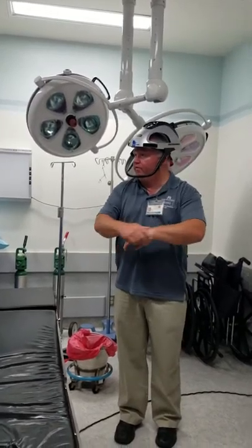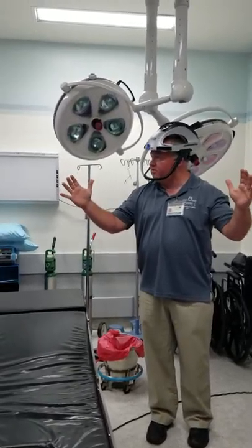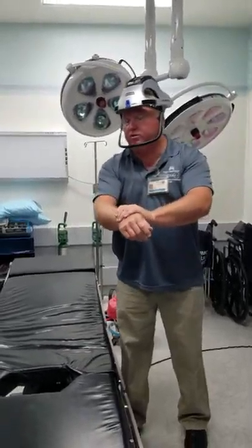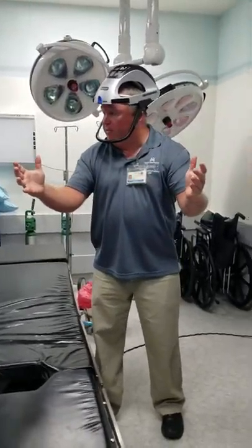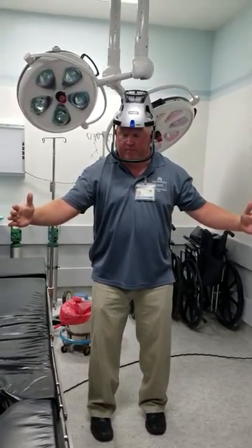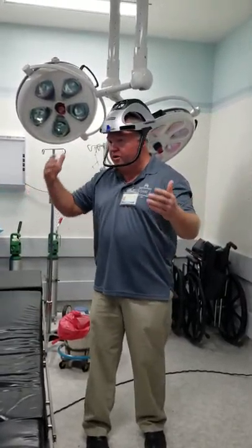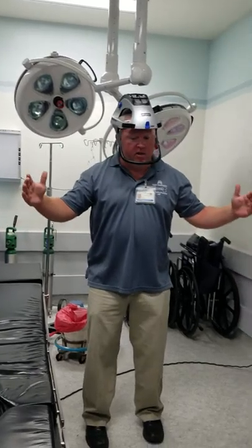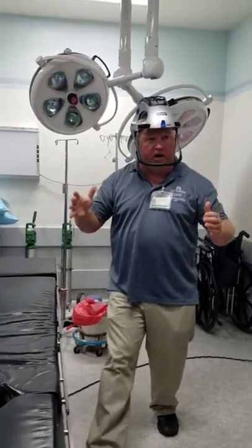We walk in and we glove and gown. You're going to get your towel and dry off your arms. Get ready to put your gown on — or you're going to put your hood on first. When you put your hood on, you leave your arms to the side. If you're taller than the person putting the gown on you, bend down and make yourself height-appropriate. They put it over the top of your head while your arms stay to the side — you can't see sometimes during this process. Arms down, they put the hood on, the nurse adjusts it a little bit, then you get a regular gown.